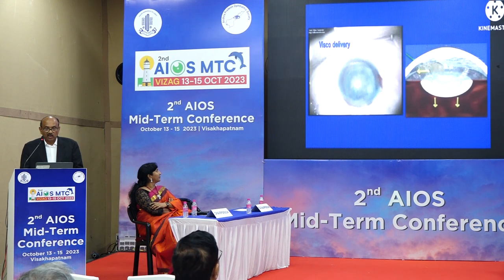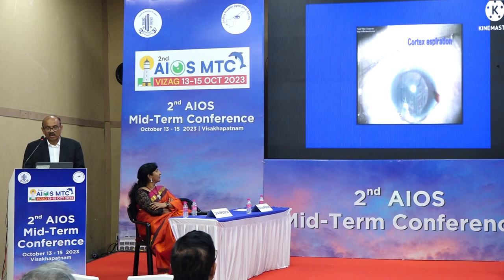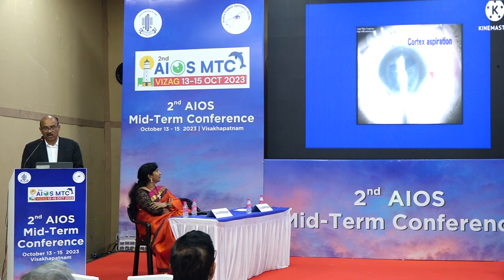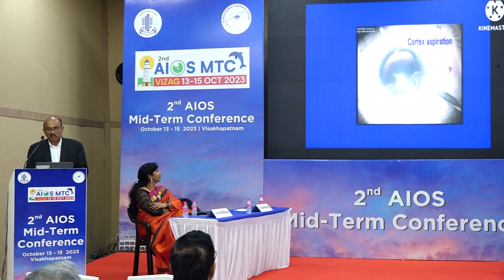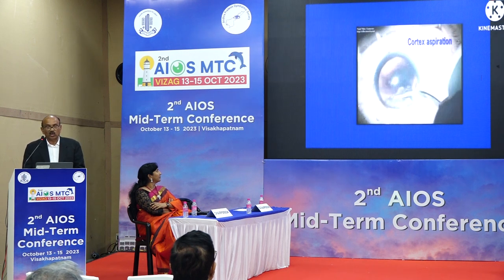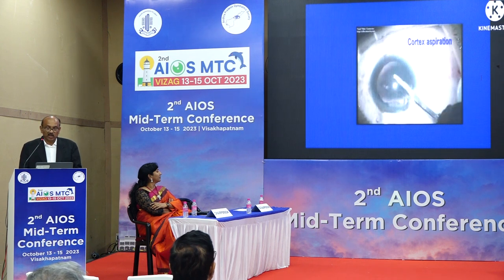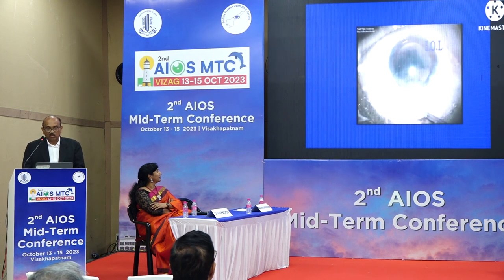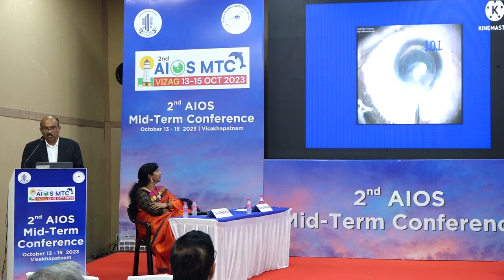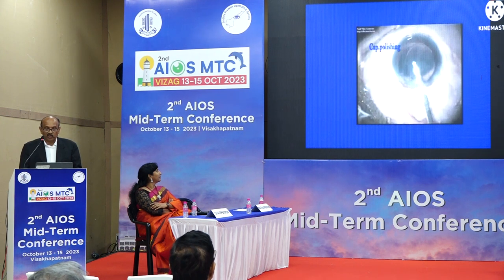In those days, we selected NS1 and NS2 soft cataracts for this, and for hard cataracts I used to do an ECCE. Nowadays, no exception: any cataract, you can do SICS. That is my 90s video, showing how I used to do the rhexis and polishing of the capsule, and you can even dial these lenses with the help of your Sinskey hook.